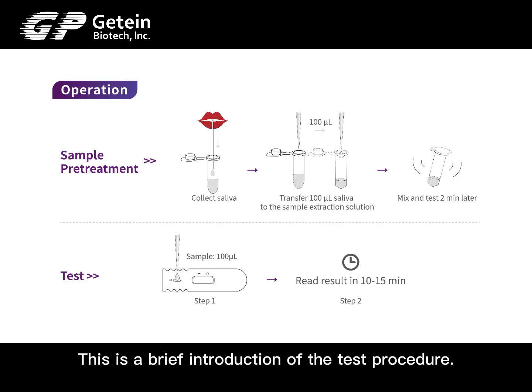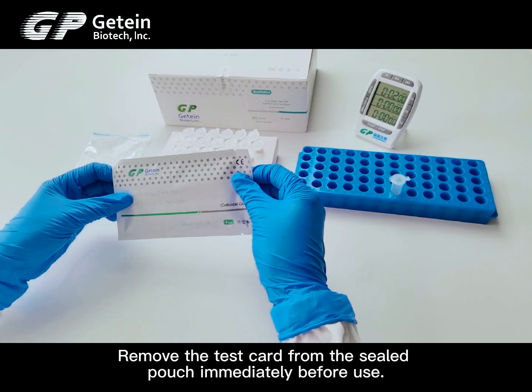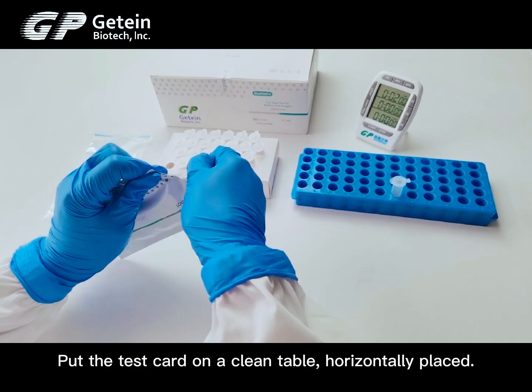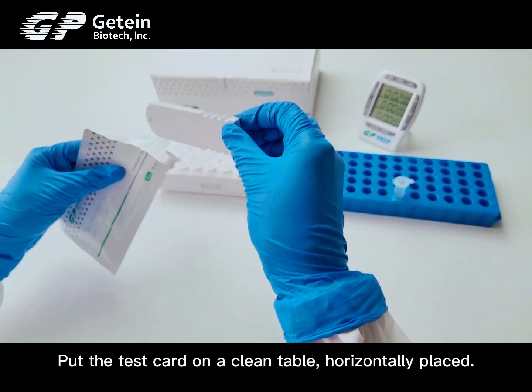This is a brief introduction of the test procedure. Remove the test card from the sealed pouch immediately before use. Place the test card on a clean table horizontally.